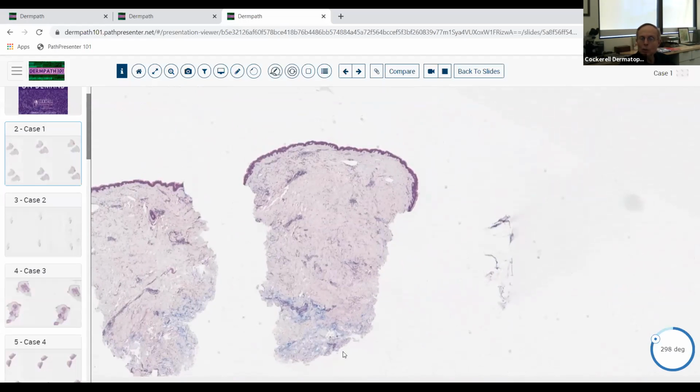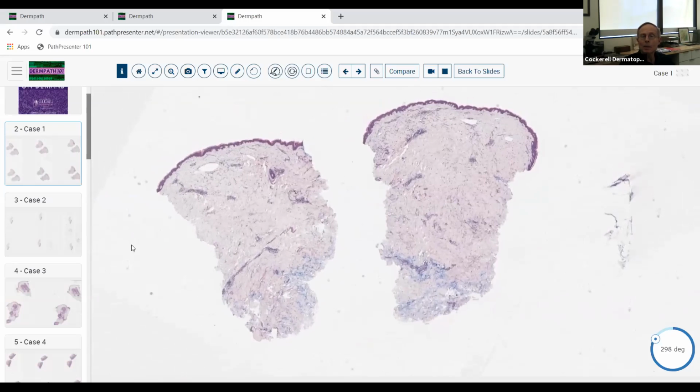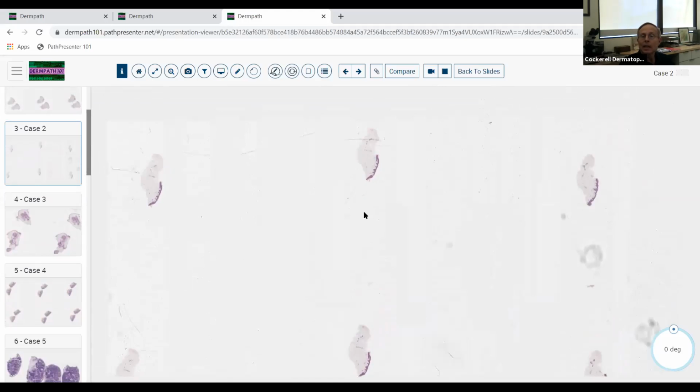If you get the very earliest stage when the skin gets edematous overlying your hands, kind of puffy, that just gives you edema of the septum in the subcutaneous fat with a little bit of mucin deposition. So that's what you see in the very earliest stage of morphea, even before you get any collagen changes. So hopefully you all were able to at least come up with that differential diagnosis and think about that. That was the diagnostic answer in that case.